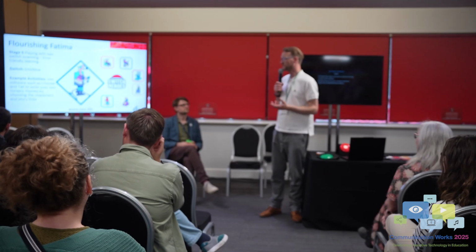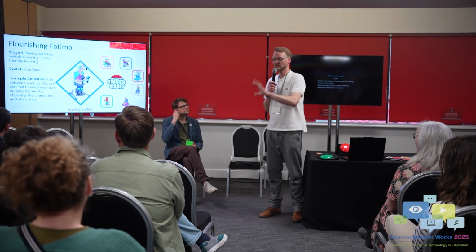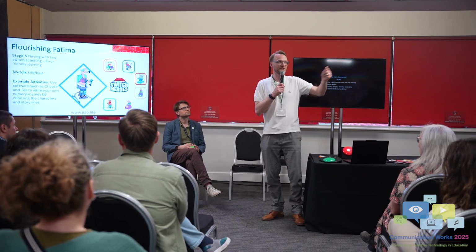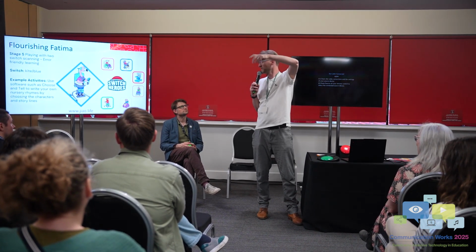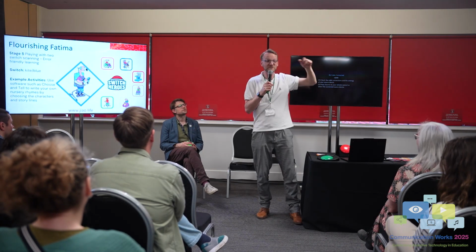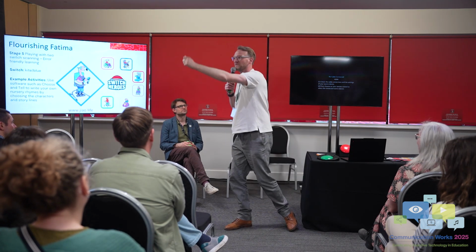Then we start to play with switch scanning, and this is error-friendly learning. So this is when, again, Charlie's video was a great example of scanning. You can do it in the room with that little, what was it, a little triangular block that they were turning around. Or you can get a hoop and you can scan around the room if you want.